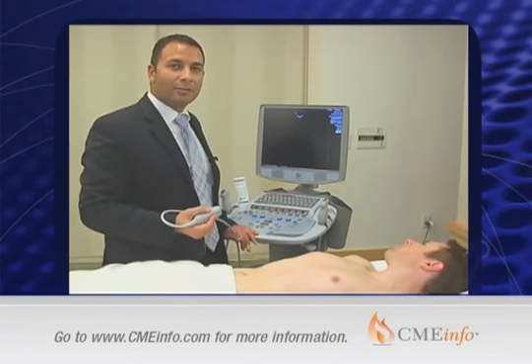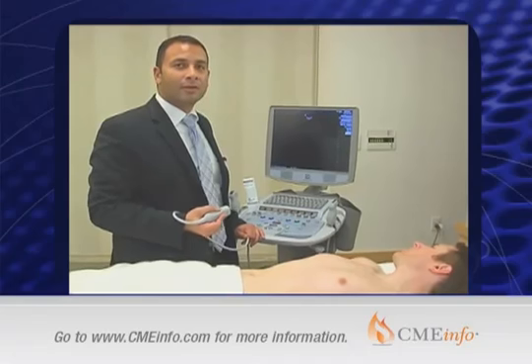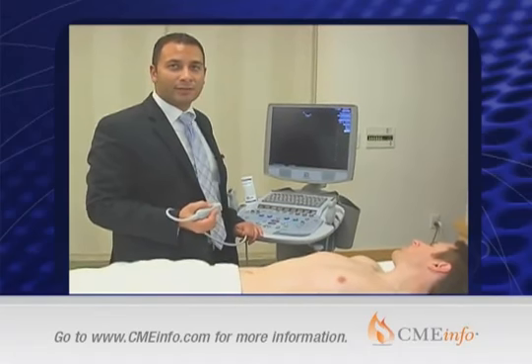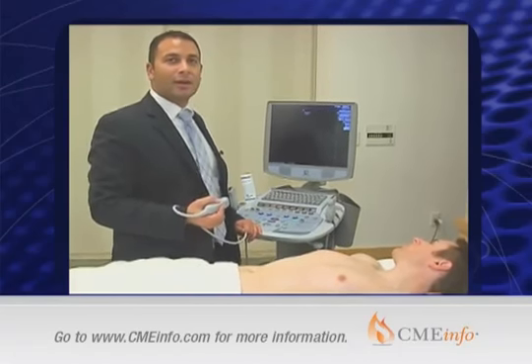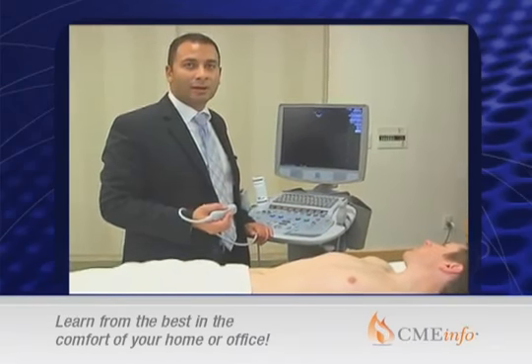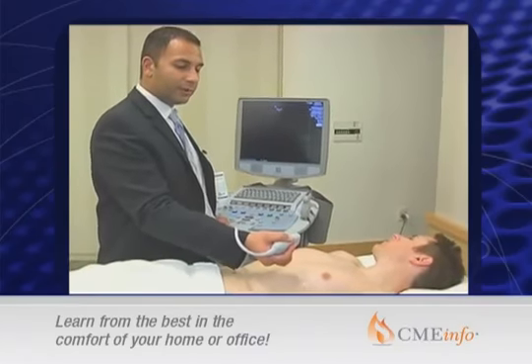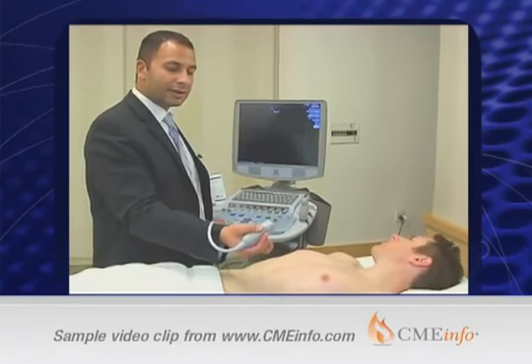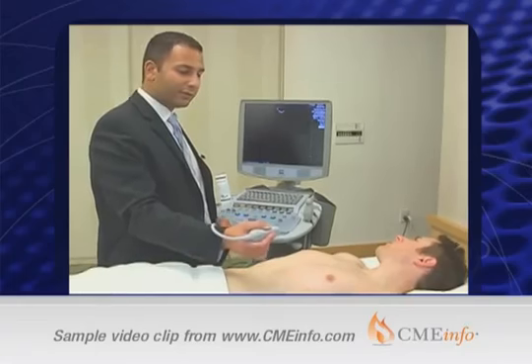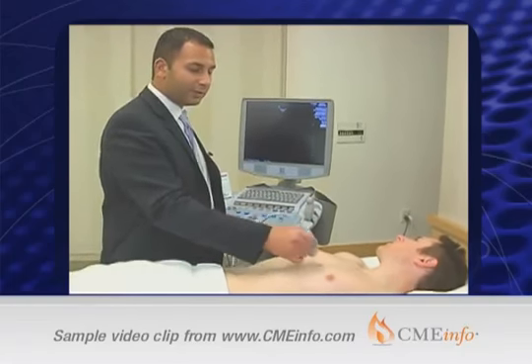Today we're going to be talking about the RUSH protocol, which is basically rapid ultrasound for shock and hypotension. And the first component in the HIMAP mnemonic is looking at the heart. So we'll start with a parasternal long axis view. We'll put the probe, in this case the cardiac probe, which is a low frequency probe, directly to the left of the sternum.